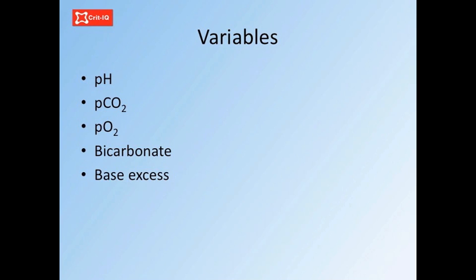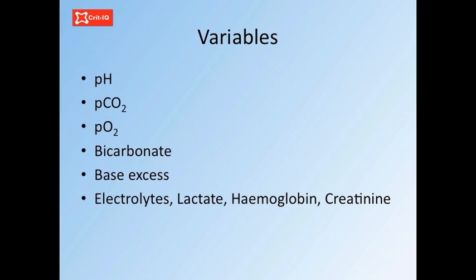In addition, a number of calculated variables such as bicarbonate and base excess are derived. Modern analyzers can report electrolytes, lactate, glucose, hemoglobin, and even creatinine. These latter values will not be considered in this vodcast.